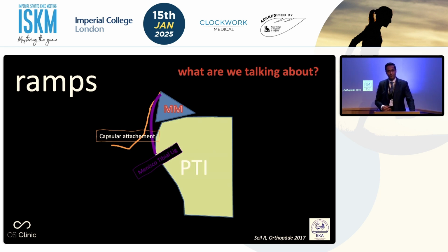What is the ramp? There's something that everyone talks about, but do we really know what it is? That's a really nice cartoon that was lent to me by one of my colleagues, Mathieu Olivier.